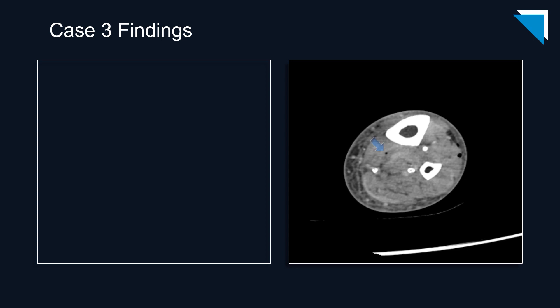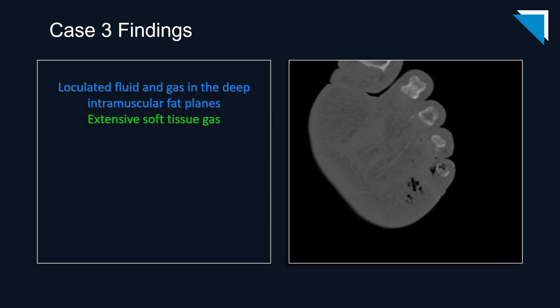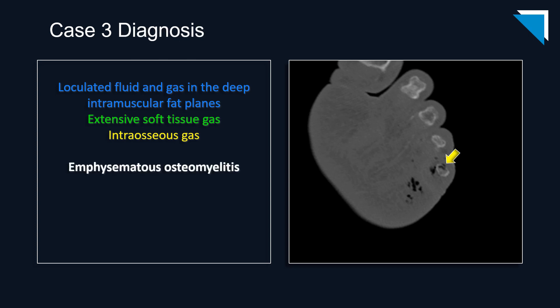Let's review the findings. There is loculated air and fluid dissecting through the deep intramuscular fat planes — quite a bit of soft tissue gas, in keeping with the history of necrotizing fasciitis. But you would really have to be dedicated to your search pattern not to miss the intraosseous gas in the fifth phalanges. This is another case of emphysematous osteomyelitis. CT scan is the modality of choice for these. It is very difficult to pick up, but if you see lots of soft tissue gas, scrutinize those bones carefully.